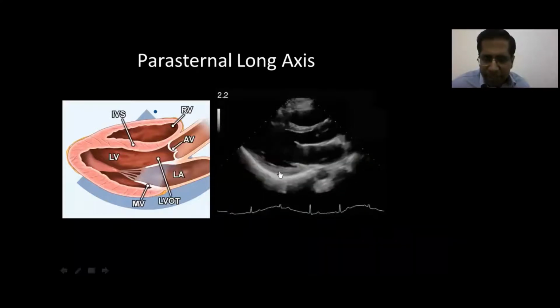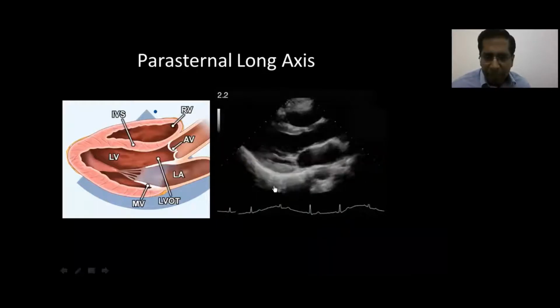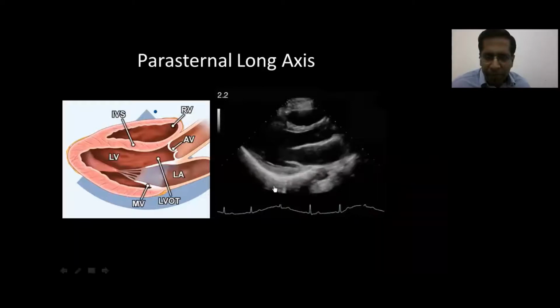In this current COVID season, the recommendations are that we try to avoid use of ECG electrodes because of concern about spread of infection, and we try to keep the protocol as short as possible. But this is talking about the guidelines and the way we are actually supposed to acquire. It may not apply in the current season when we might alter the protocol.